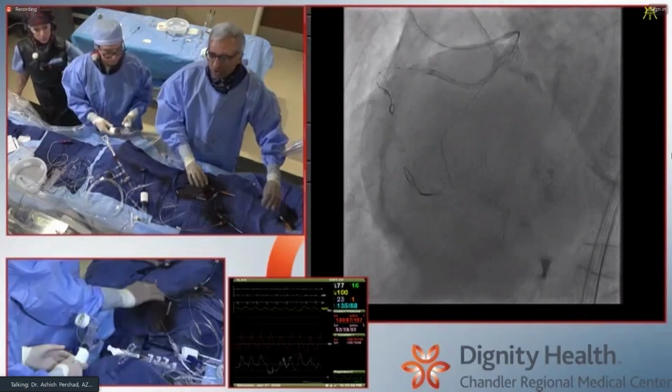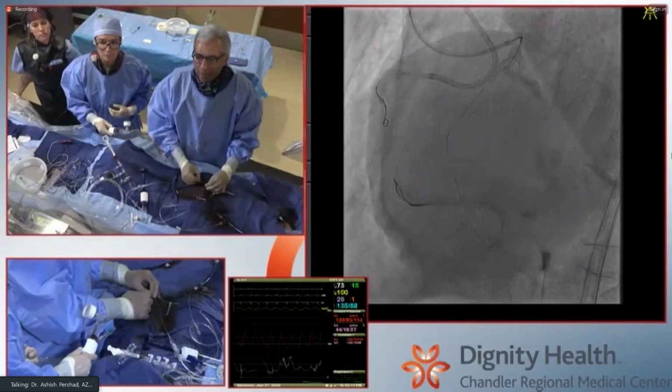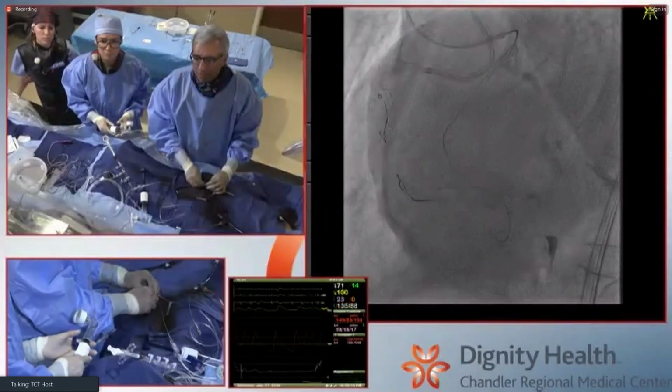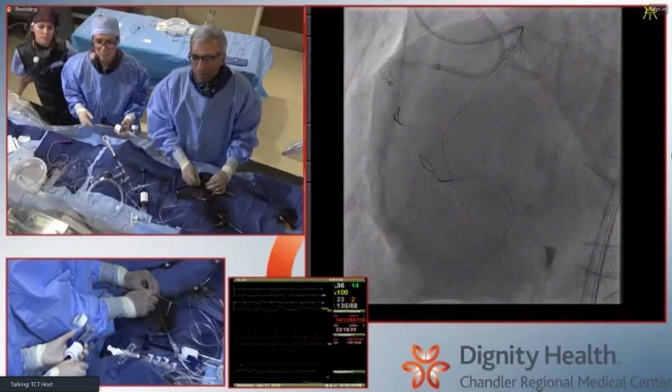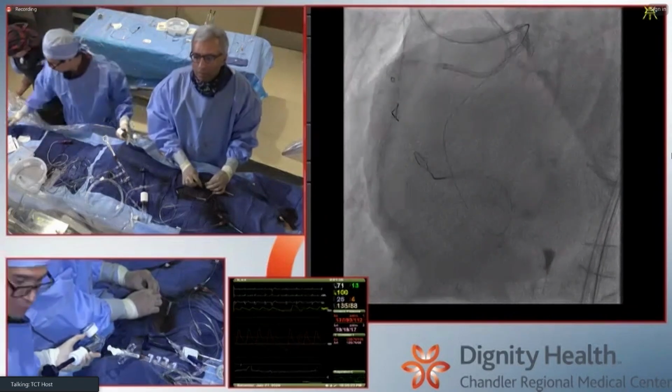Did you see that, Sanjog? I was able to get the guide liner, trap liner down, past all that, and I'm now sort of in the true vessel. For reverse CART puncture, sometimes I would prefer Conquest Pro 9 or 8-20 if it's very hard. That's just inflating the balloon and aiming up at that thing.